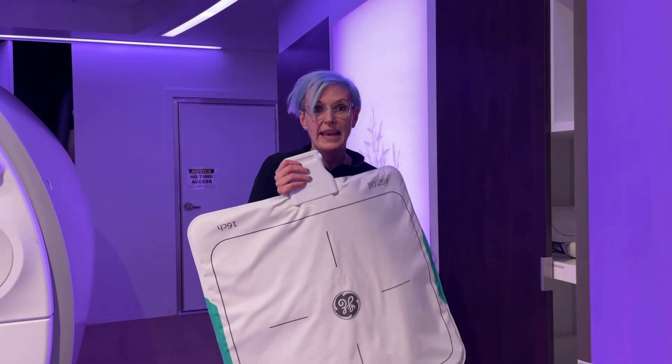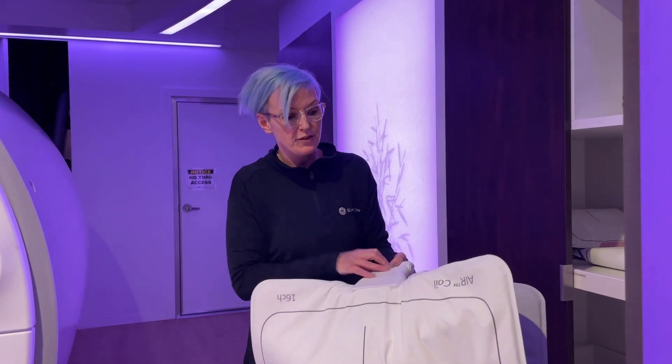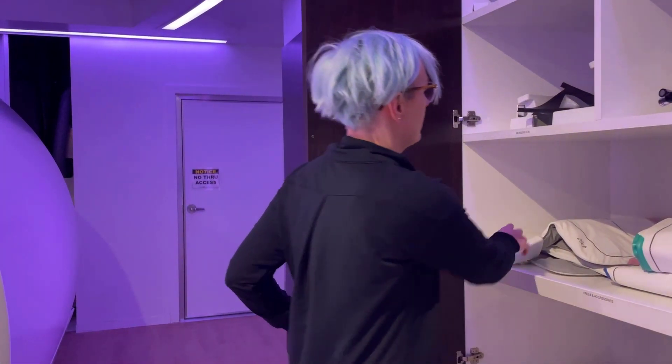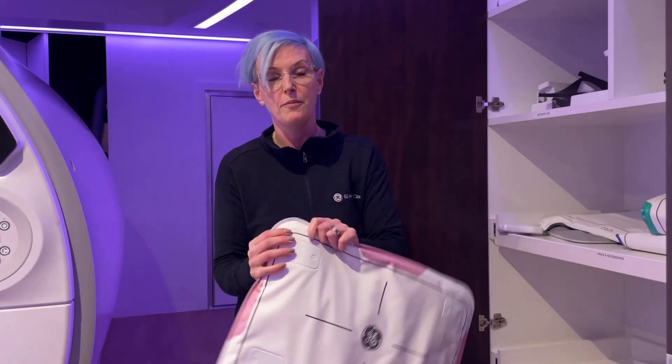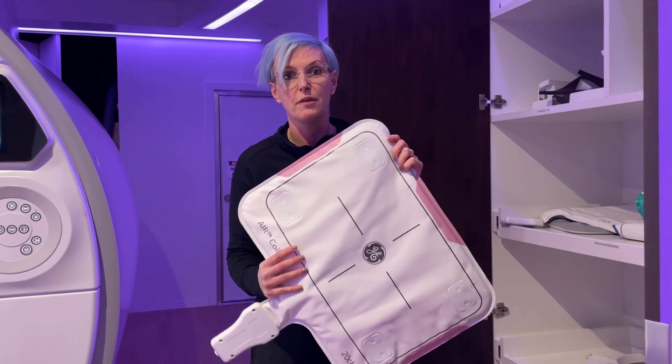It's way less weight and way easier for me to grab one. And if I decided to not use the large one, I just stock it back in the cabinet and grab the other one. So really way faster and way more comfortable, not only for the patient but also for the technologist to just work with coils.